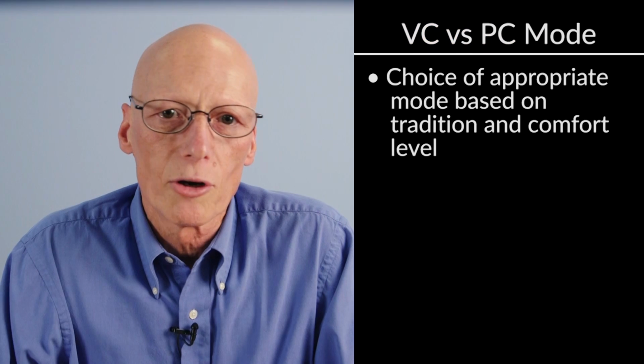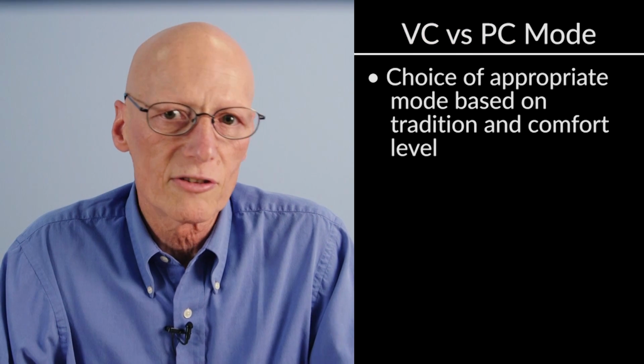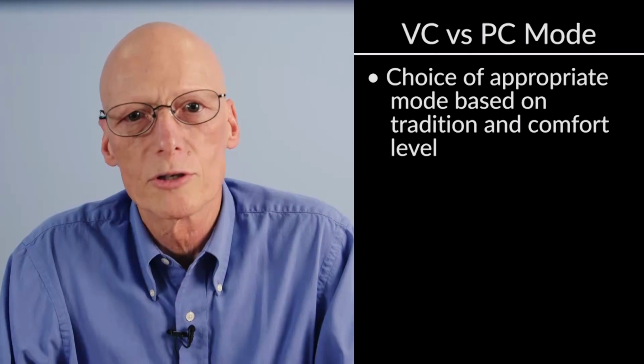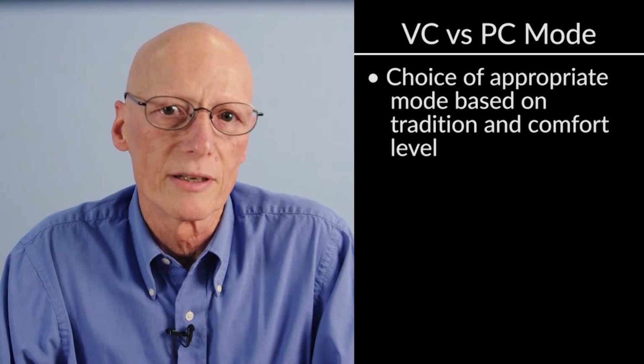Having said that, the choice of modes of ventilation, whether it's assist control or SIMV, pressure control or volume control, is very much based on tradition and comfort level.